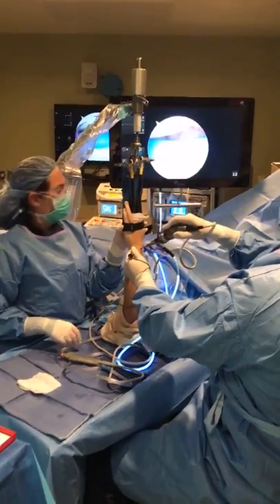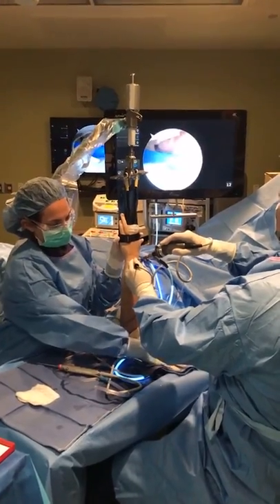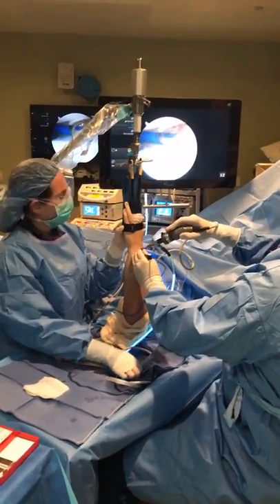Okay, this part looks pristine. You get over here, a little more inflamed. So this is the ulnar side or the pinky side of the wrist.